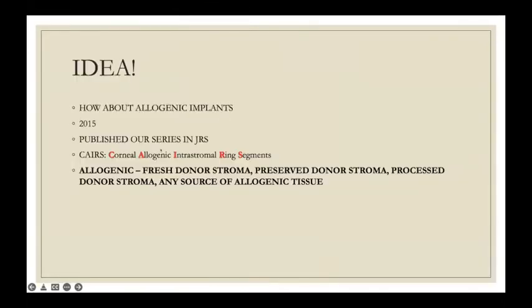So I had this idea in about 2015 about using allogenic implants, basically because I wanted to get rid of the use of synthetic substances within the cornea. And we published our first series in the Journal of Refractive Surgery.